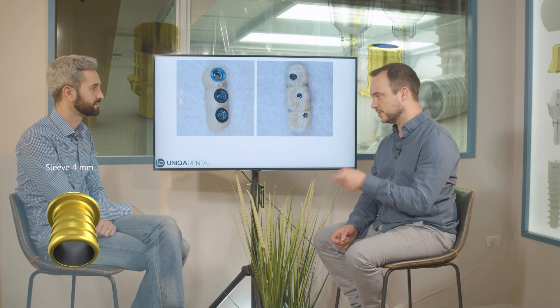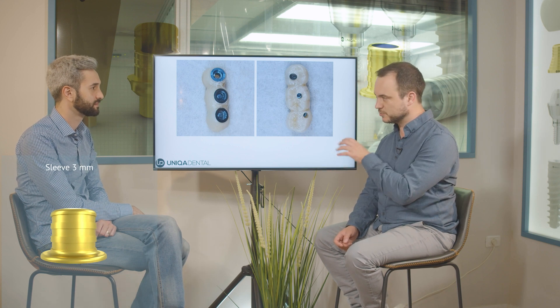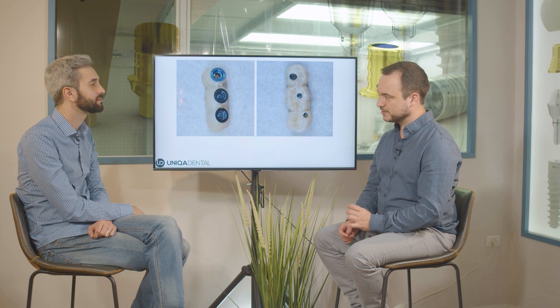When using the V-type multi-units, you have different types of sleeves. If you use the 4mm sleeve, there is an option to use the small screw channel — where the screw itself is embedded inside the bridge between the sleeve and the crown. The size of the screw channel is only for the screwdriver hex inside to tighten the screw.